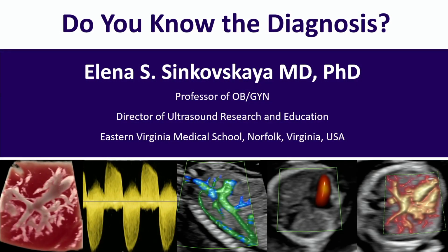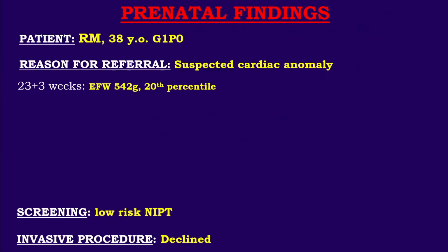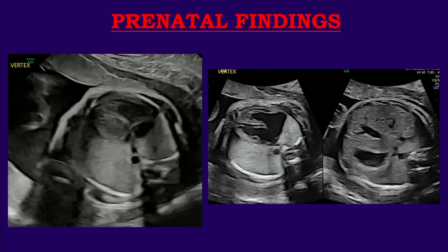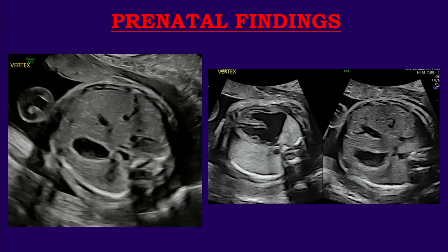I'm going to make it quick. So that patient was referred for a suspected cardiac anomaly. This is where we're going to put it all together. So remember, we talked about the position of the heart within the chest.